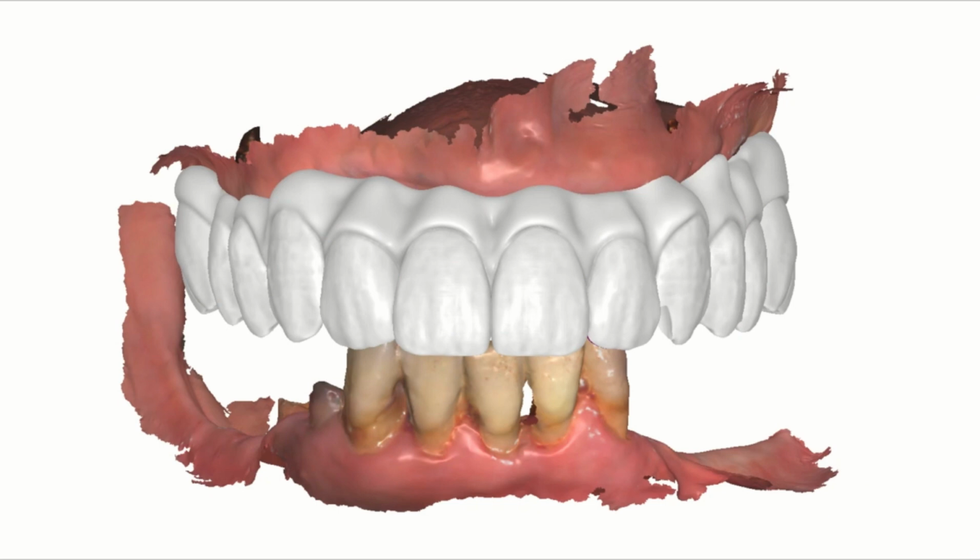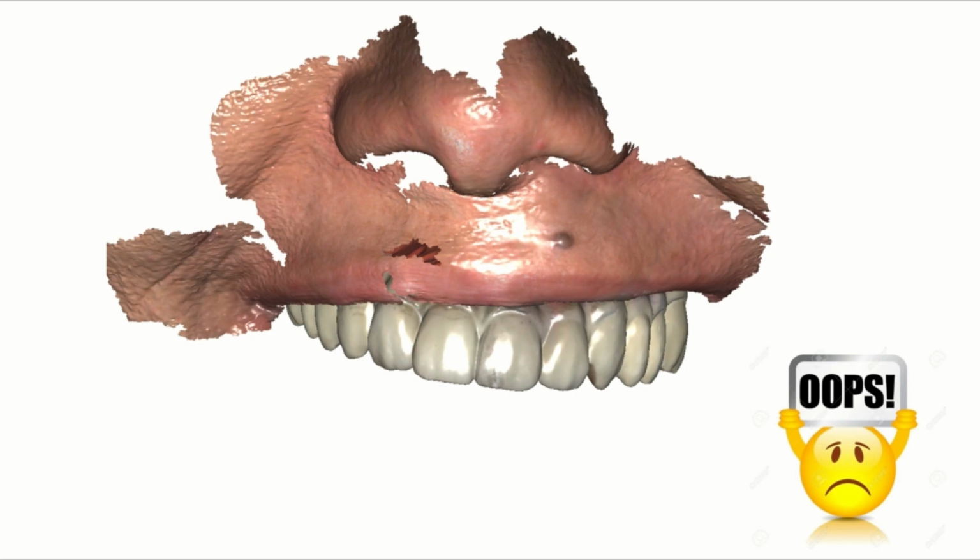We go back to our case. We designed our procedures virtually, but we don't know if it is the right maxillary orientation or not. And guess what? In reality, there is a surprise. Bad news. It is not the correct maxillary orientation.